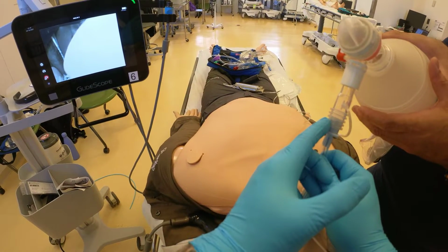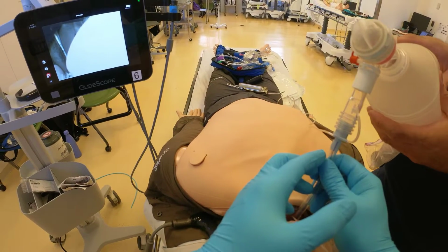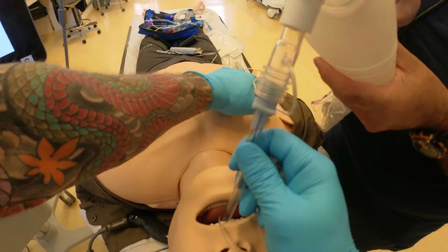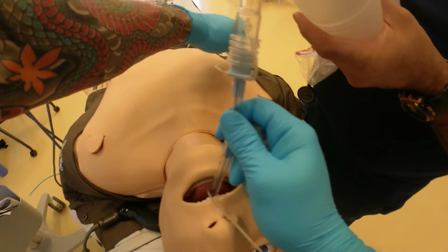Objective data, right? Positive end-tidal CO2, 35-45, right? Pulse ox, positive pulse ox, 95-100, objective data. I auscultate my lungs out mid-axillary because I want to know that I didn't write main stem. So positive sound, right? Positive sound.